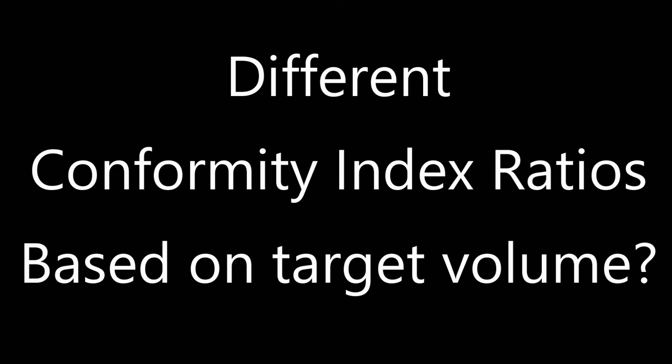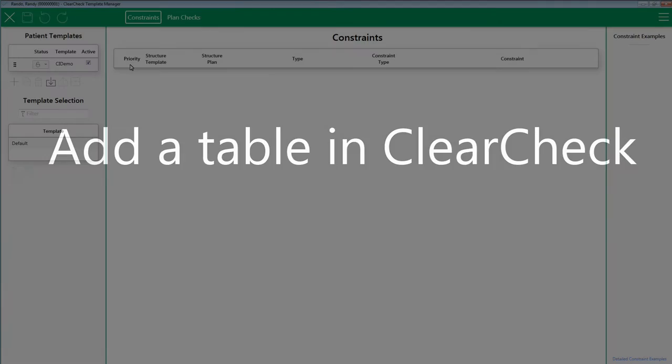You might be asking, what if you want different conformity index ratios based on the actual size of the PTV? For example, as your target size increases in volume, you may be able to accept a much lower ratio when compared to a smaller target size volume. Instead of figuring out what target size volume is for each plan and manually setting your limit and ideal ratios, you can simply set up a table.